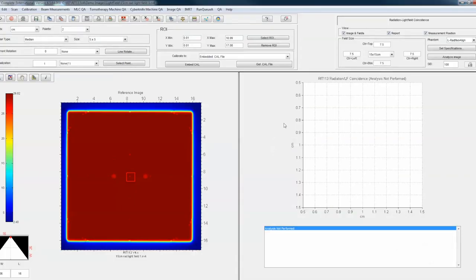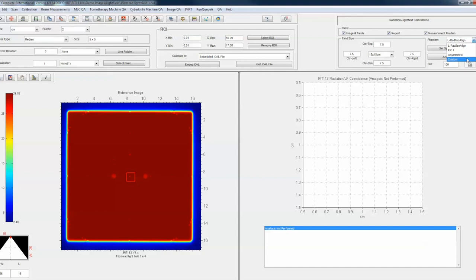Going back to the light field routine, this works with our LRAD phantom or with the iso-align phantom. IBC used to make a phantom for this. We can also do asymmetrical fields, which we'll do next, or there are some custom phantoms people use for that. But let's stay with the first option: either our LRAD or the iso-align.